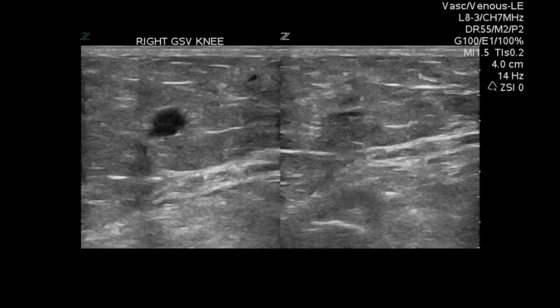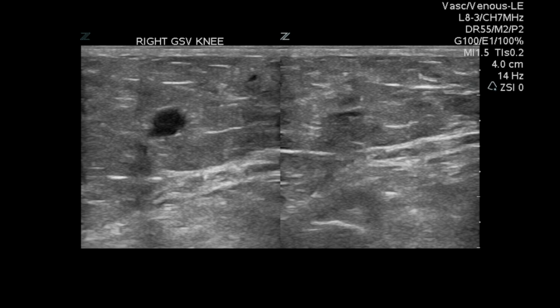Once we've established that there is no blood clot on the right side, no deep venous thrombosis, we can now concentrate our efforts on why the patient really came in for pain and swelling, mainly below the knee.